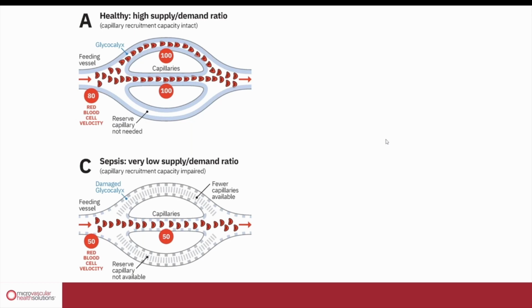If we count the number of smallest capillaries in a healthy individual, as shown on top, compared to a person that is exposed to risk factors and is experiencing some early or late damage to his microvascular system, one of the key findings is that the numbers of capillaries significantly drop in an individual that is exposed to risk. So on top, you can see the resting conditions, so low blood flow conditions, in this example, 2 capillaries are being perfused with red cells, and at similar or even lower blood flow levels in an individual that has a compromised microvascular system, you will see that fewer capillaries are being perfused under resting conditions.